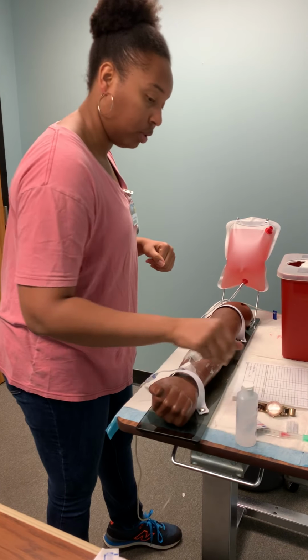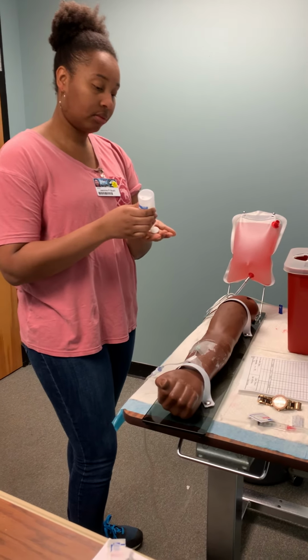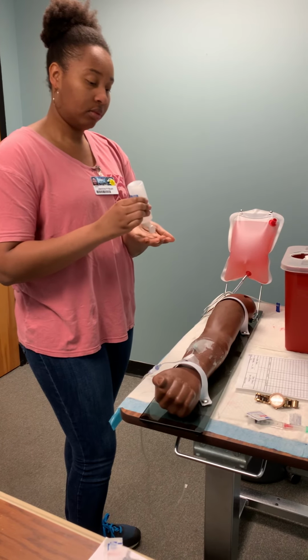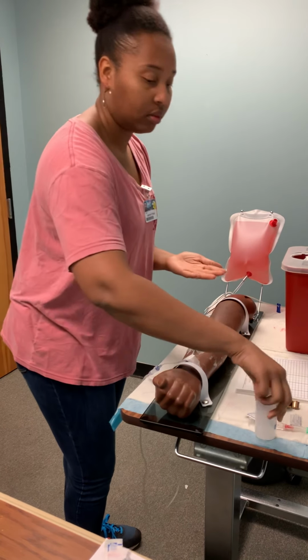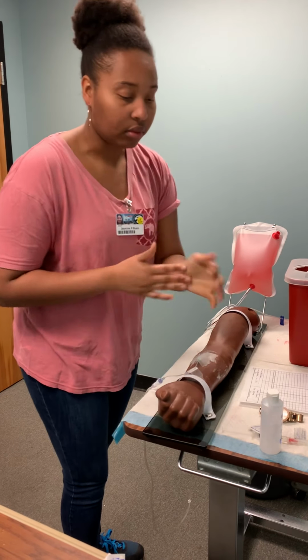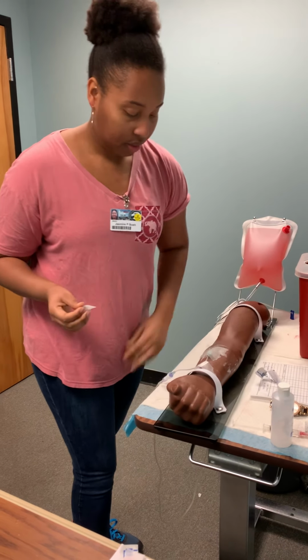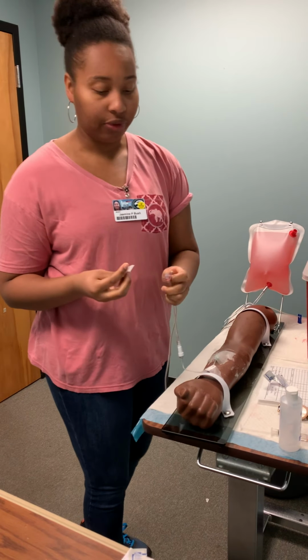So I would wash my hands again. I'll find the port closest to the patient and I'll scrub the hub for 15 seconds.